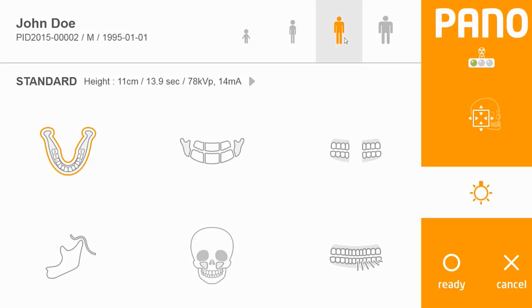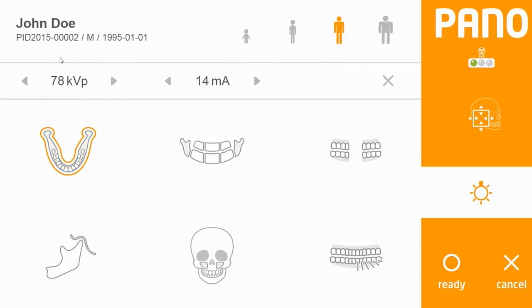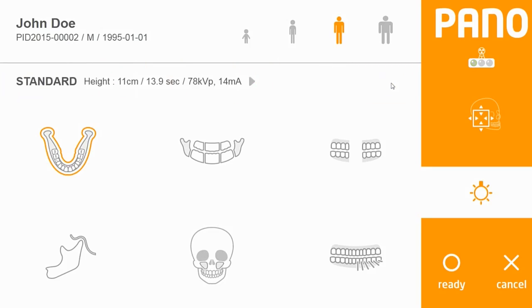If these preset sizes are not adequate, you can change them using the manual adjustments with KV and milliamp settings. The middle section of the window shows protocol options — the default is the standard panoramic option, and this video will guide you through taking an optimum panoramic image.